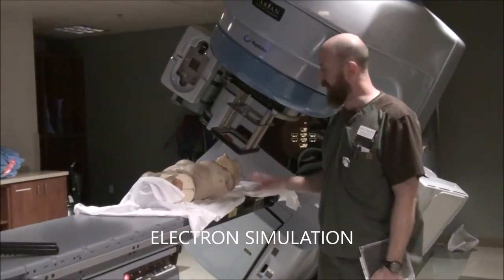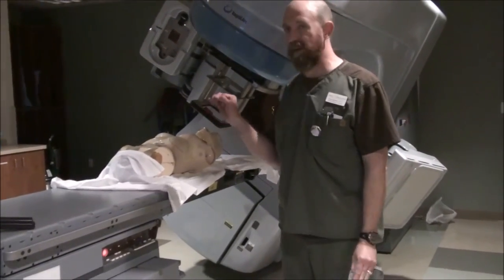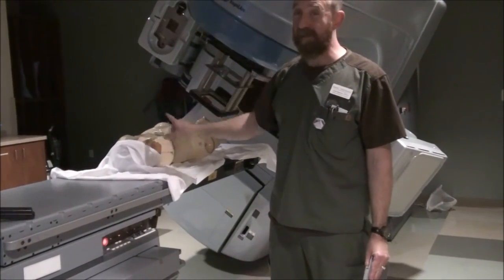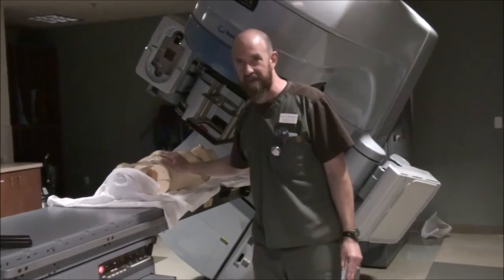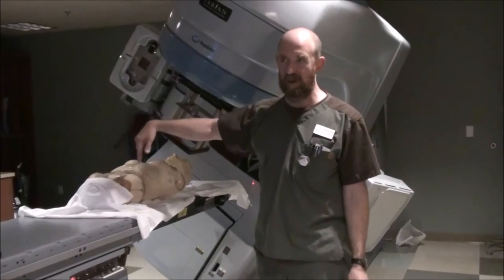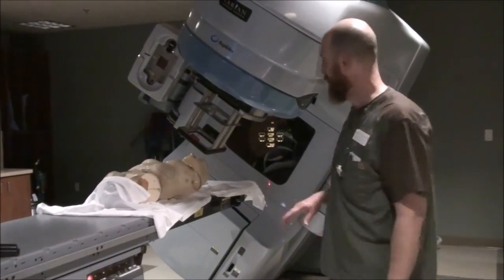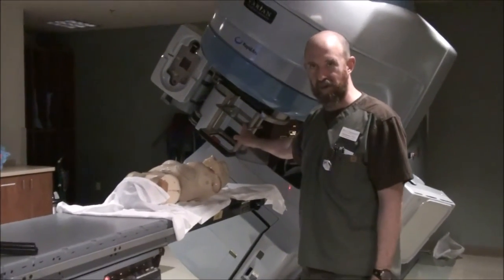We're going to go over electron simulation. Electron simulation is relatively easy. Most of the time you do an electron sim, it's going to be inside the treatment room. If you have to do one in an actual sim room, it becomes more difficult because you have extended distance to deal with because of the cone, and then you've got the image intensifier limiting where you can keep tables. If you have a Varian machine, you're going to probably have a cone that looks similar to this.